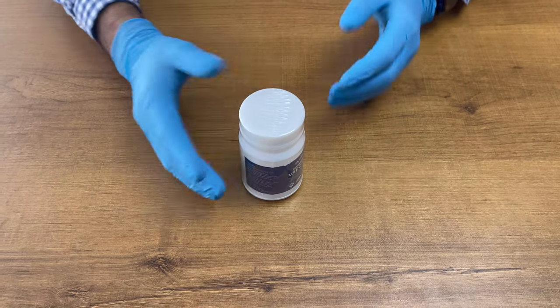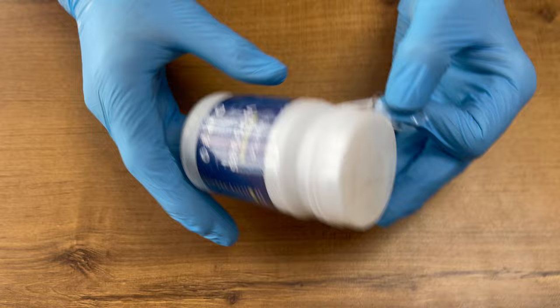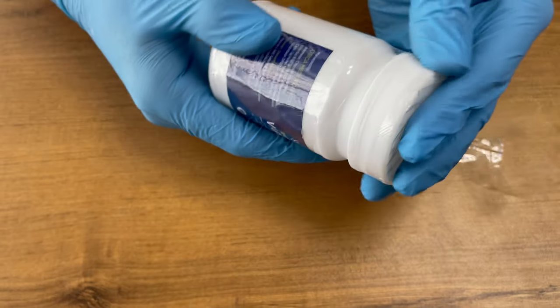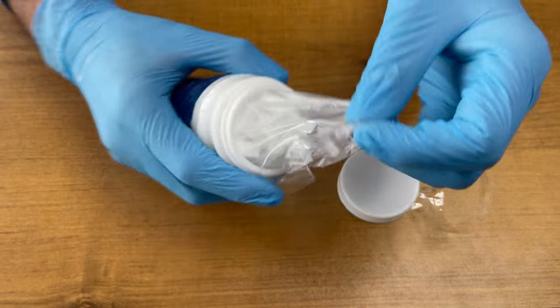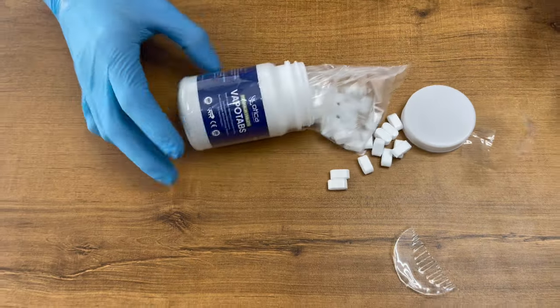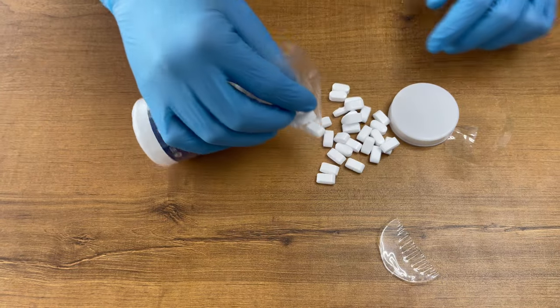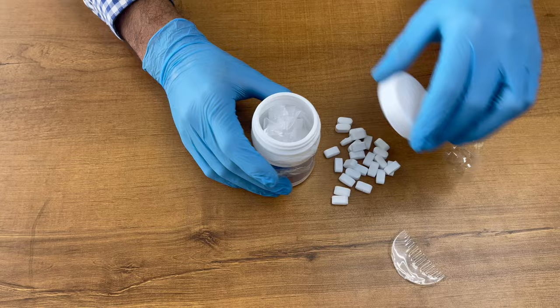We can use this tablet in the formalin chamber. So we are going to open it now to show how it comes inside the packaging. This is how the formalin tablet comes — and you just need to keep this poly bag inside.